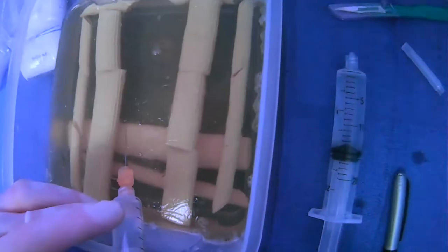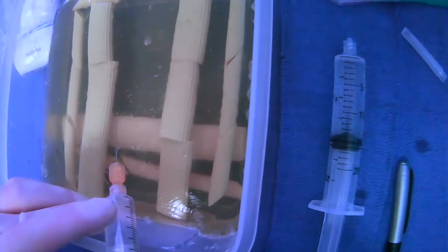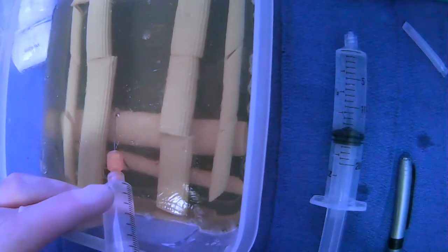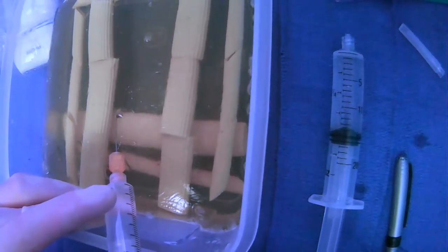Wherever we made the skin marking, I can see it right here, we're going to just make a little skin wheel, drip, drip, drip, drip, little wheel here, anesthetize the skin.